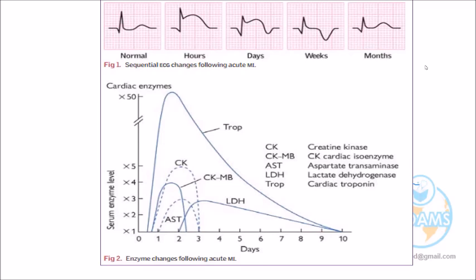It is in the acute setup or in the chronic one. Chronic one means that in later life also, if MI happens in any area of the ventricular wall, and Q wave is associated, this Q will persist for life. So in future, if we see any Q wave in the ECG, we cannot say this is acute myocardial infarction.